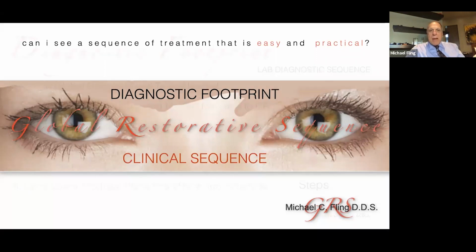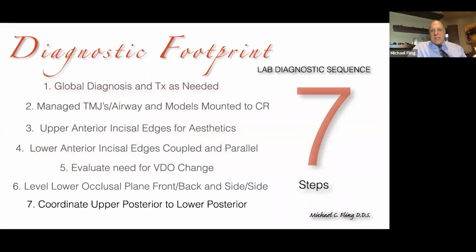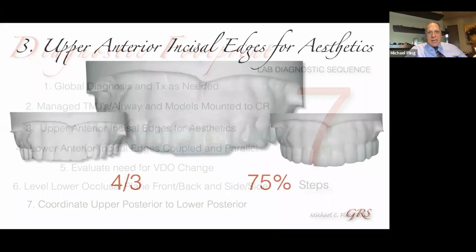So with that in mind, remember what I said, the diagnostic footprint is the part that we do in the lab. And these are the steps that I go through. And I'm not going to spend a lot of time on these other than to say, I do a lot of diagnostic wax-ups in my practice. I'm at the lab bench a lot doing them myself. Now, it's probably not practical for most dentists to do your own diagnostic wax-ups. You may not have the time, or you just may not enjoy doing it. That's the reason I do it, because I like it. I just think it's fun. So if not, I still want you to get a diagnostic wax-up, which would typically be from your lab technician.